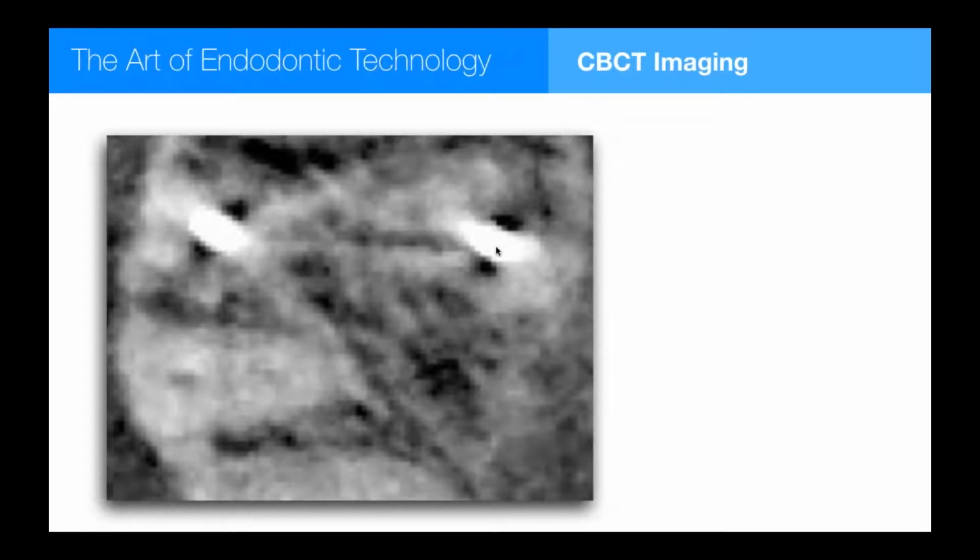So when I'm doing a 4-canal molar, if I can't find the 4th canal, I'm going to go ahead and treat the distal buccal and palatal roots. I'm going to bring them back for a second appointment and look one more time. Many times having a fresh outlook, not being tunnel visioned in like you tend to get, I'll open up an access and go, oh my God, it's right there. And it's a different place than I was looking. So what I do now is if I can't find it on that first visit, and it's usually an hour and a half or 2 hours, I bring them back.